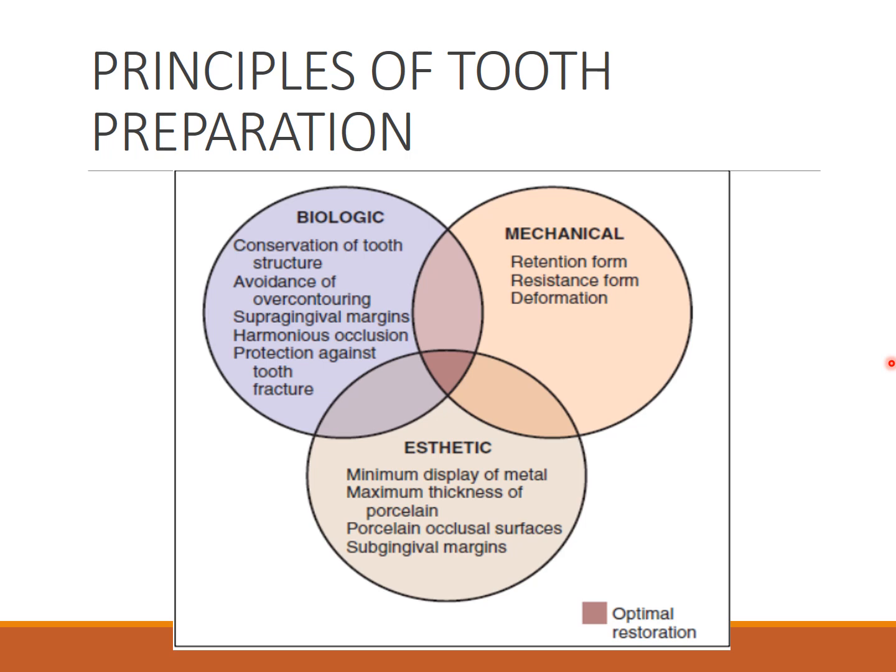Which again means that if there's a short crown, it would dislodge. The length of the preparation is very important. If the preparation is long, there would be no tipping. Path of insertion is important, guys. It should be parallel.